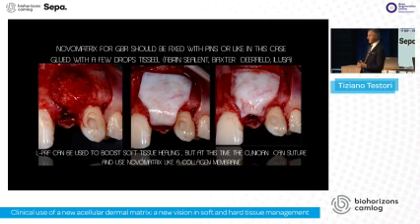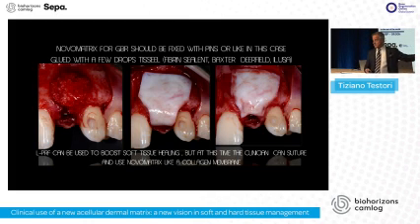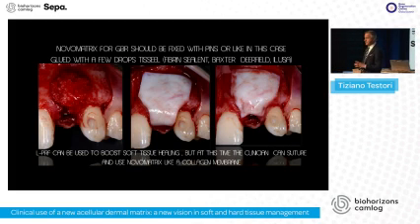And as Anton Sculean was telling us, it stays and releases growth factor for 9 days, but in the meantime, as we did in this case, you can close your flap, and if you don't have PRF biotechnology, it will heal, and the matrices anyhow will do what is meant to do, bone regeneration and soft tissue augmentation.